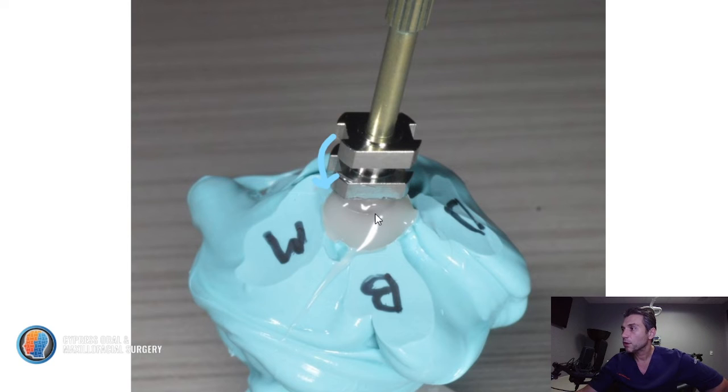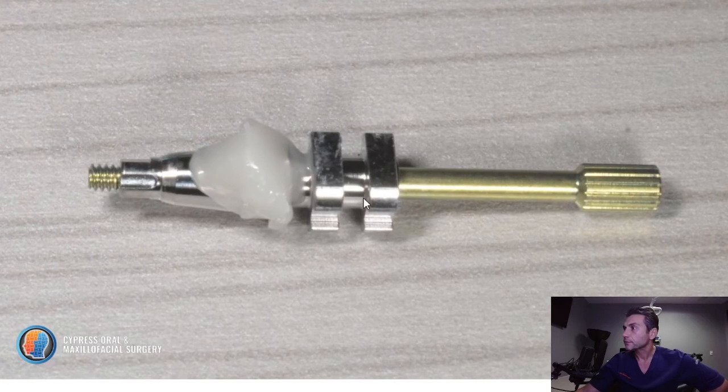Sometimes you may want to use a black marker to mark the buccal aspect, because it's easy to get lost when you transfer this to the mouth. When you take it out, that's what the construct looks like. So now you have indexed how you want the gum to look to the laboratory, and we transfer this whole thing to the mouth.